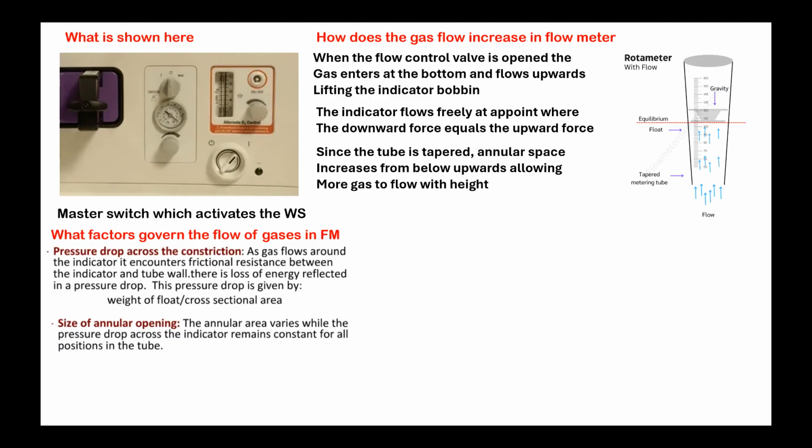Excellent. So whenever viscosity is high, will it have low flow or high flow? Low flow, sir. Low flow, it will be sticky, just like the difference between water and honey. If you take a spoon of water and pour it, water will drop easily, whereas honey will take a long time to come out of the spoon, isn't it? A simple example which is given in school. So viscosity indicates the resistance against which the flow has to occur, whereas density indicates the mass per volume, rightly said. So at low flow, which one works? Which one is important for the flow to happen?